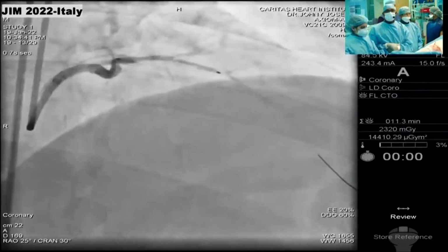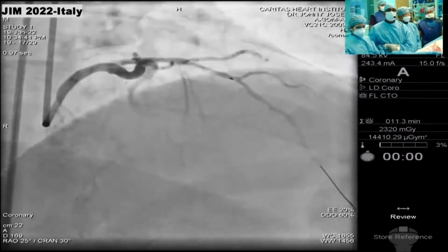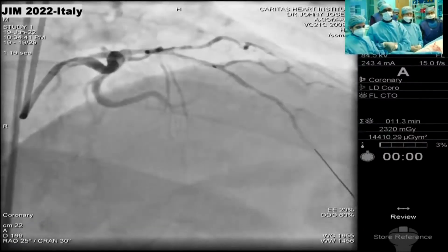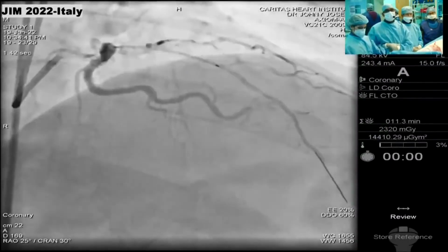So I see a long stent going to be implanted. We have another 20 minutes. I think we should let them go ahead and see how it comes, and then discuss the result once we see what comes out of it. So please go ahead.